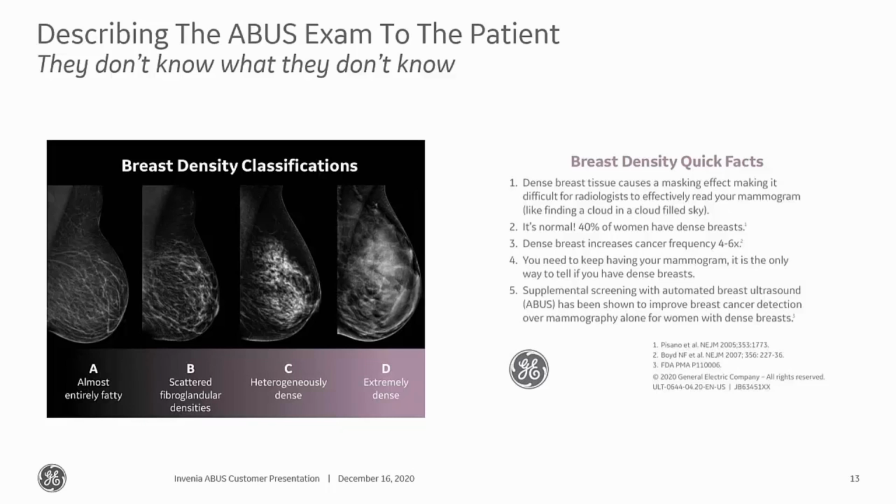And hopefully you guys all have these little pocket cards. I know all of us like to try to leave them with you during the install training, but if you do not have them, reach out to one of us. We can get them to you. This information also came with your marketing kit whenever you got the system.